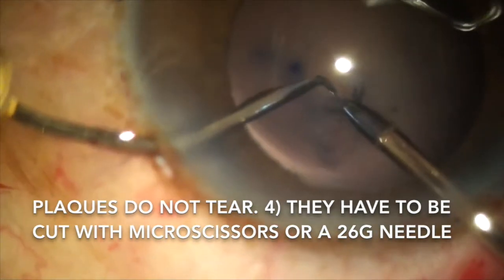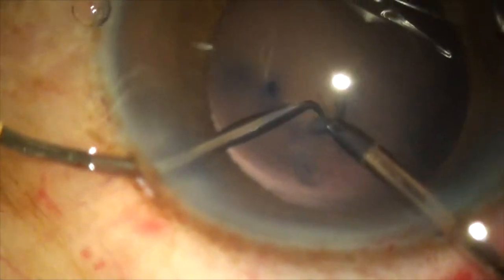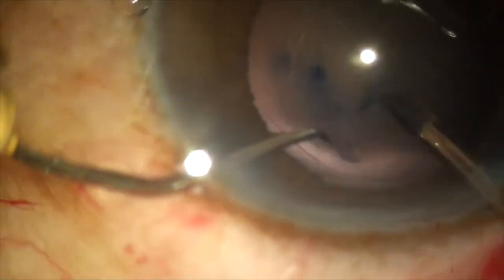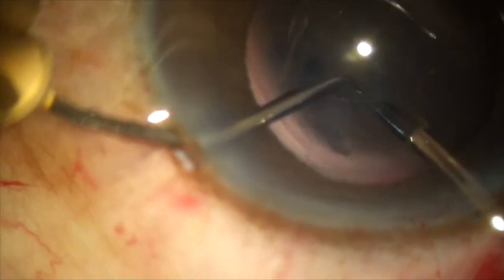Posterior capsular plaques do not tear. They have to be cut — either with micro scissors, which is the best way, or they can be cut with the sharp edge of your capsulorhexis 26-gauge needle.